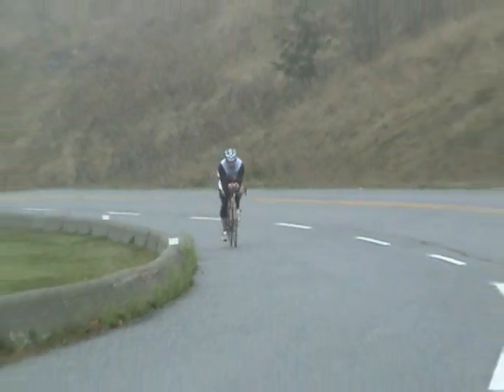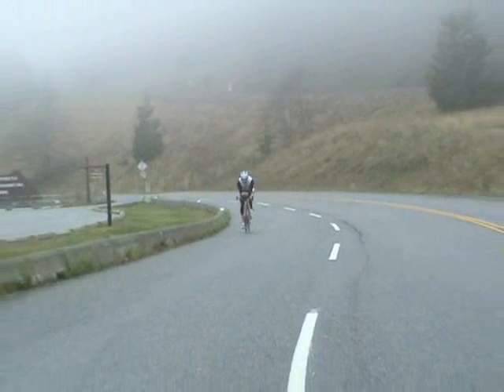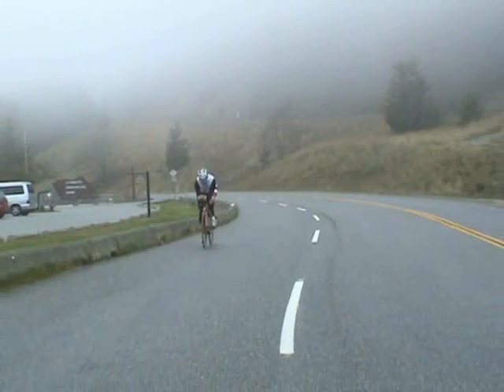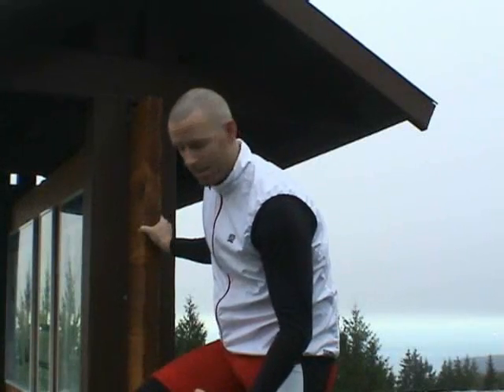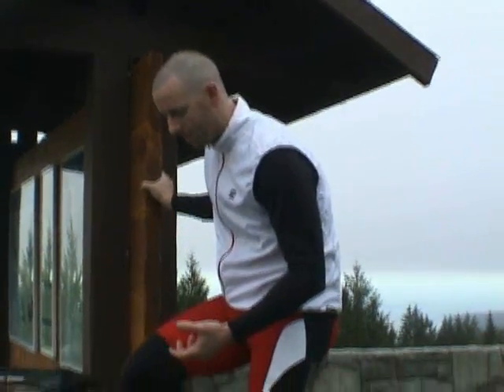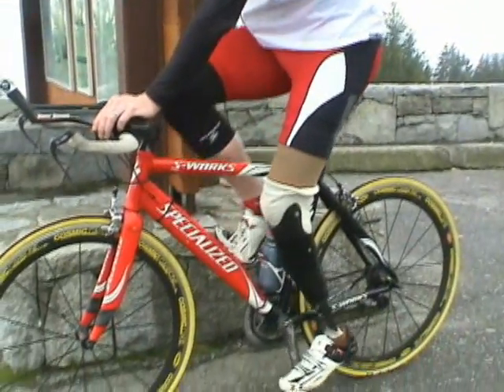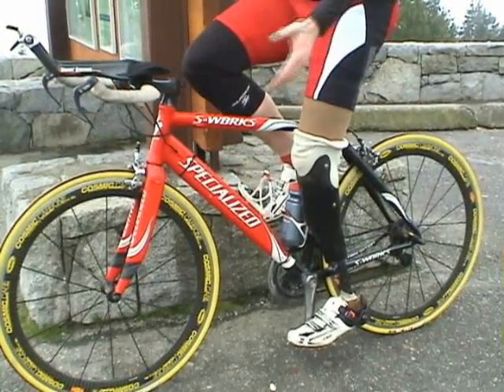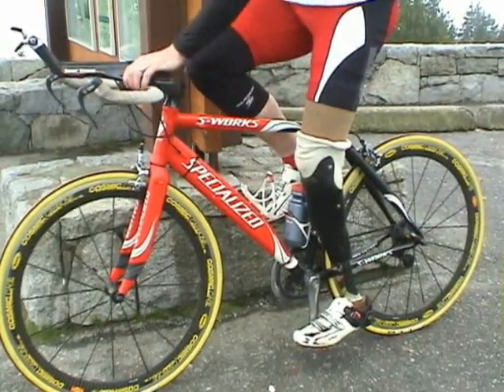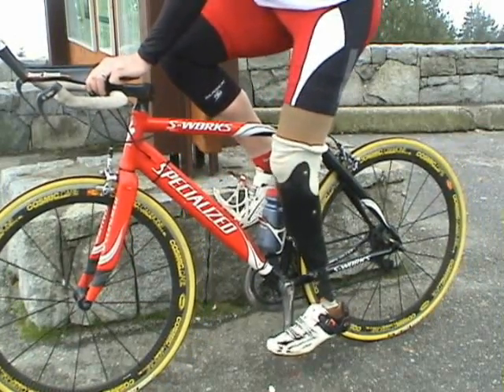One of the challenges that I faced when I first started riding, and that I know a lot of other amputees face when they want to start cycling more seriously, is that you want to use a pedal system that involves cleats so that you're actually attached to the pedals and can generate the most power. However, that creates an issue with getting out of the cleats, which even able-bodied cyclists find difficult at times, but it's extremely difficult to rotate the heel out hard enough to disengage from the pedal.